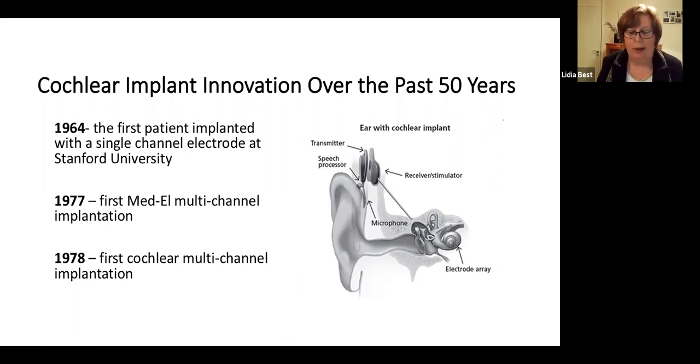The cochlear implant is an implanted electronic device designed to produce useful sensations of hearing to a person with severe to profound deafness. The job the implant does is electronically stimulating nerves inside the inner ear. Usually the implants have two main components. One is the externally worn microphone, sound processor and system. The second is the implanted receiver and electrode system, which goes inside the cochlea. Those devices are held together by a magnet. That is the shortest possible description.